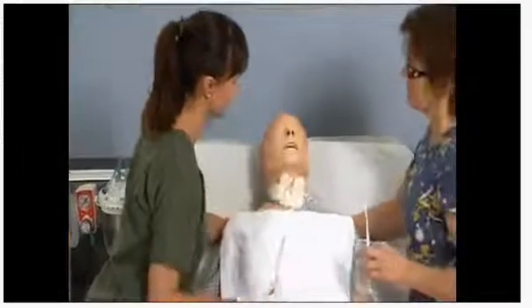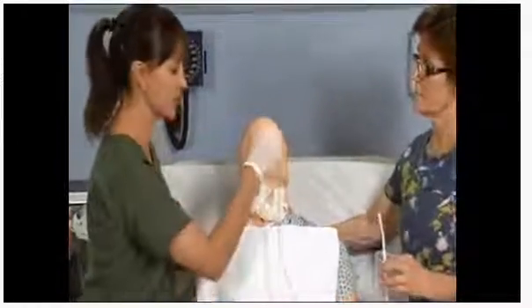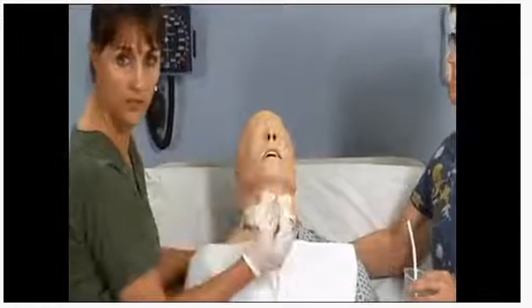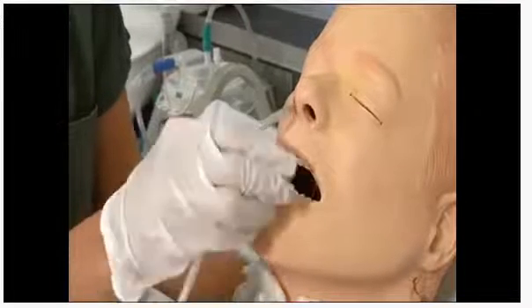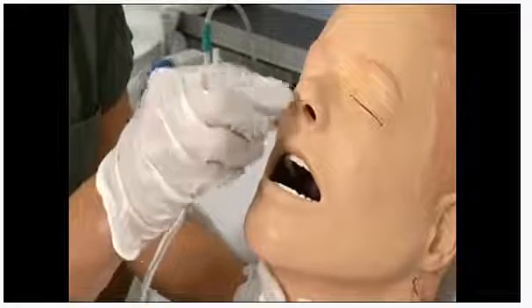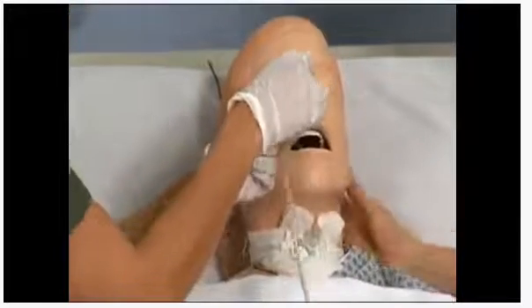Let's have you sit all the way up. Now, for camera purposes, I would be holding the NG tube up a lot closer to the nasal area, but that way you can see it. I'm going to hold it a little bit further back. All right, Mrs. Jones, are you ready? Here we go. And advance, and she may raise up her hand and say she feels it in the back of her throat. Okay, so I'm going to go ahead and stop at this time and just hold it right there. Don't let go or you'll lose it.